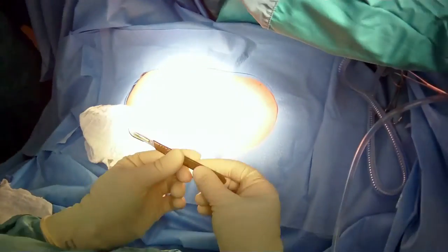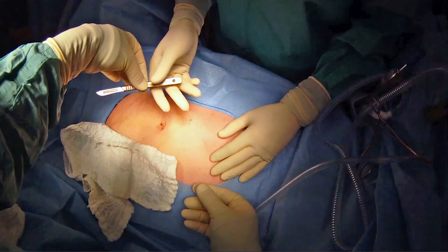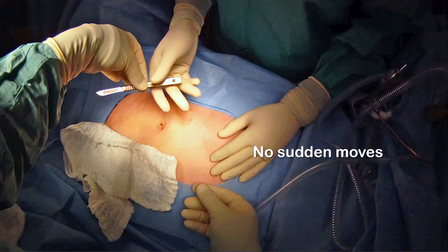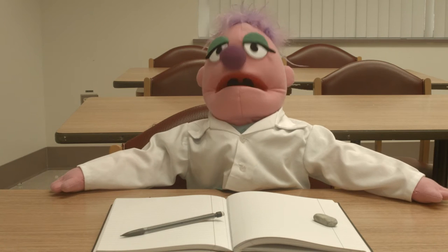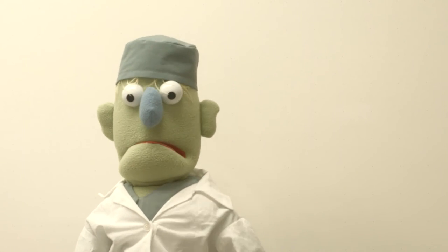The nurse is going to give you the scalpel like this, holding it by the back. You're going to take it in your hand like this. When you're done with it, you hand it back the same way. Never give it back sharp end first. Always hold the scalpel by the middle of the handle when you're moving it. No sudden moves. And remember to say 'sharp.' Are you getting all this, Alex? Yes, there's a lot to remember. Anyone can cut, but only a surgeon can wield a scalpel properly.